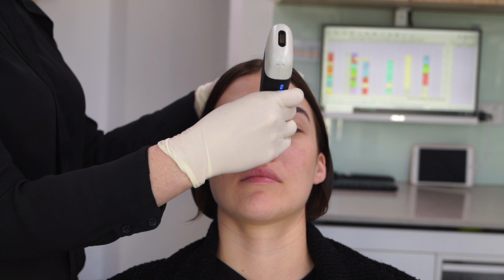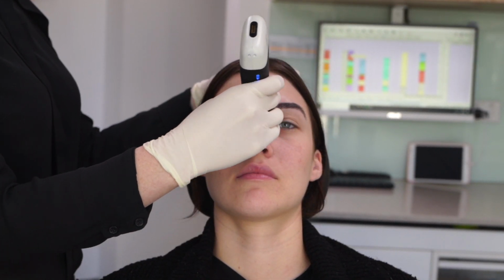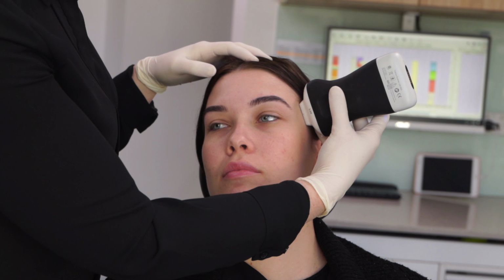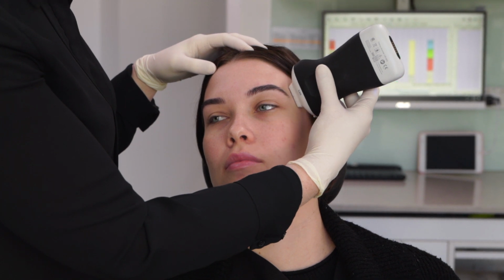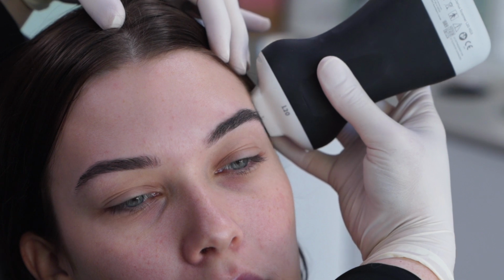Here we are looking for the lateral nasal arteries, the dorsal nasal arteries, and the intercanthal veins. To assess the temporal area, we place the transducer at the hairline and slide up and medially to the brow. Important arteries to review here are the transverse facial artery and the superficial temporal artery.